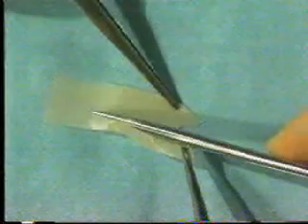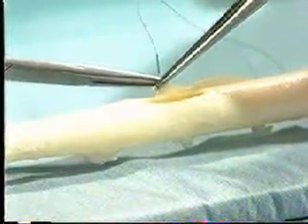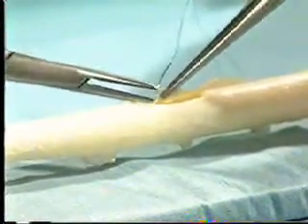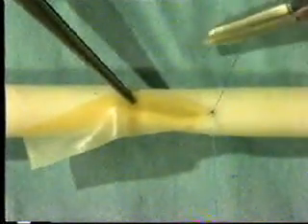Using a 5-0 prolene suture, insert an initial stitch at the shaped apex of the patch from outside to inside, and then from inside to outside at the apex of the arteriotomy. As before, be careful not to drag the needle through the arteriotomy but roll it through, and then tie the suture using several throws of a formal reef knot.